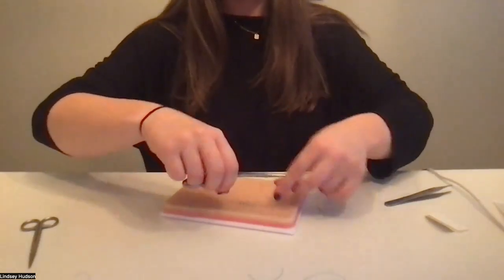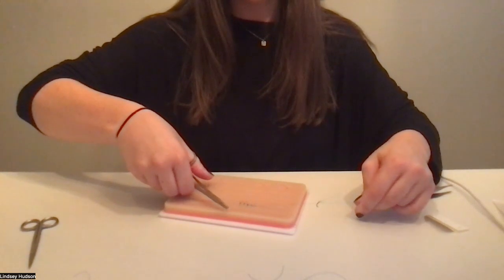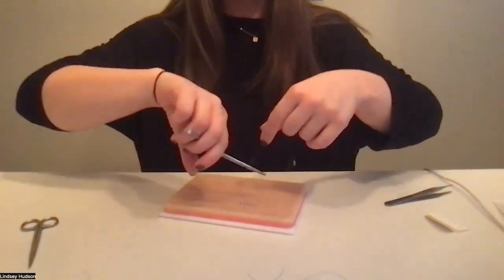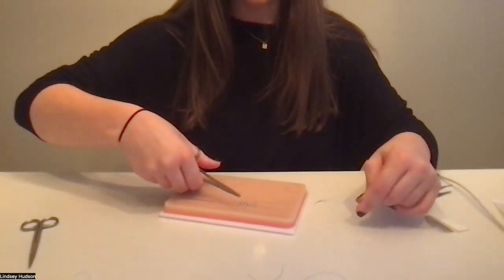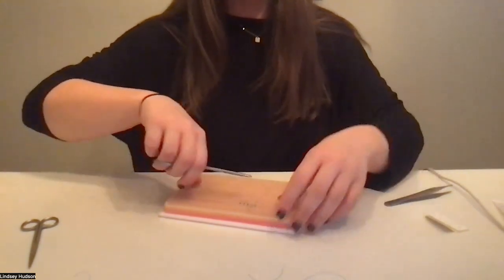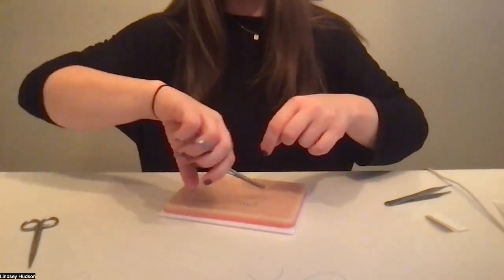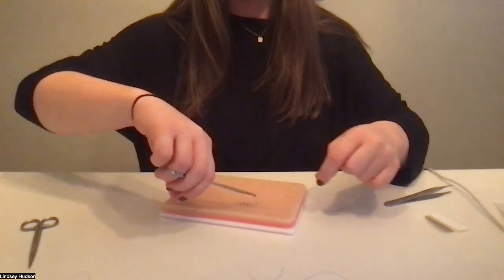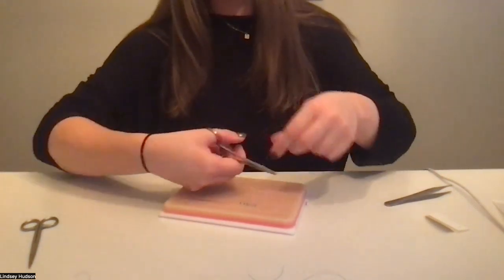twist 2 times, grab your tail and pull it through, under, over, and under.